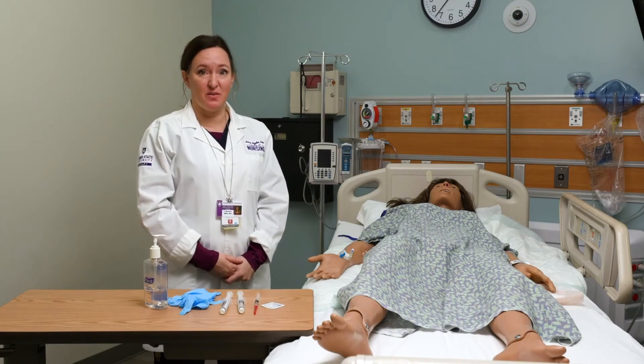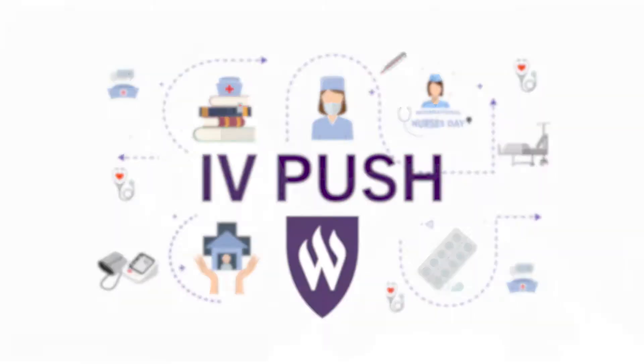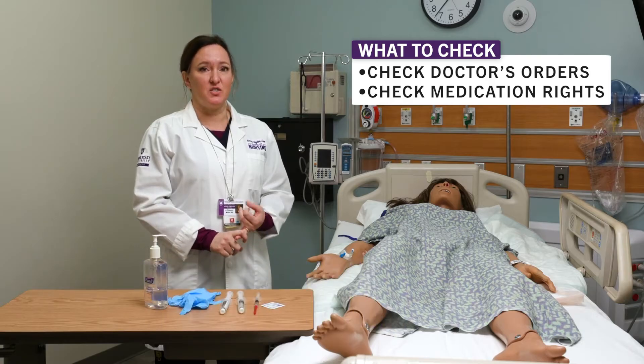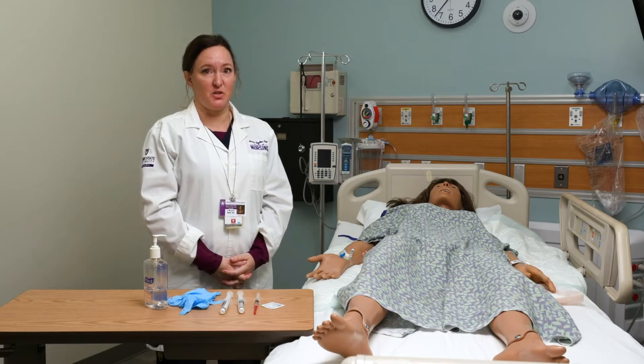I'm going to show you how to do an IV push. Before you do your skill, there are several things that you want to check. You want to check your doctor's order and always do your six rights, or ten rights, or however many medication rights you've been told.